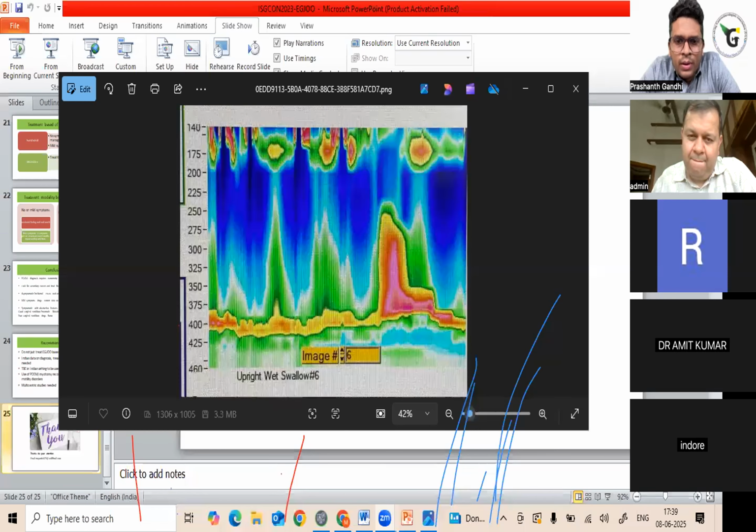Okay, yeah. So Dr. Aditya has reaffirmed. So basically, important to remember that even one normal swallow rules out achalasia. From a peristalsis perspective, yes, 100% abnormal peristalsis. Here they would have the peristalsis per se normal from the body, isn't it, sir? Yes. So in achalasia, what you typically find is mirror image contractions. You have completely failed motility, and you have mirror image contraction, one swallow followed by similar swallows, a mirror image pattern that you will see in all types of achalasia, very, very classical. Which you would not see in other motility disorders.